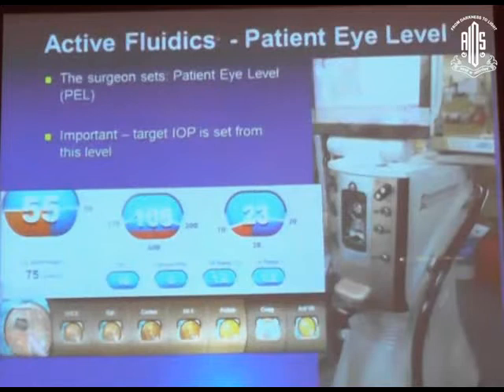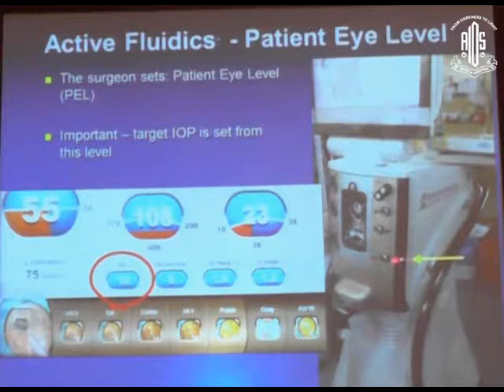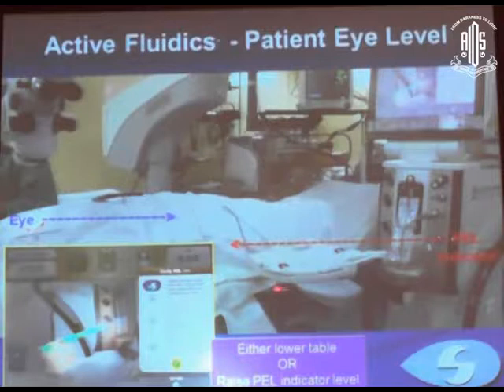The first thing we do is to set the patient eye level with the machine level. Now, as you can see, this is what is called the PEL. The patient eye level is just not this much, whereas the eye level of the PEL and the machine is this much, and the patient eye level is this height. Now, these have to be brought together by either raising this or lowering the other.